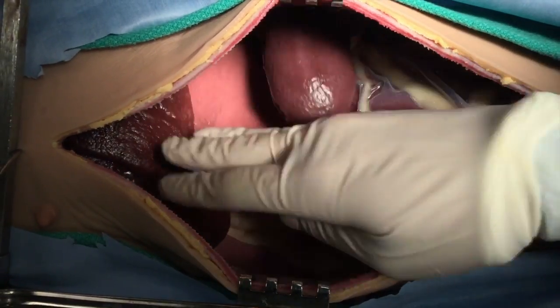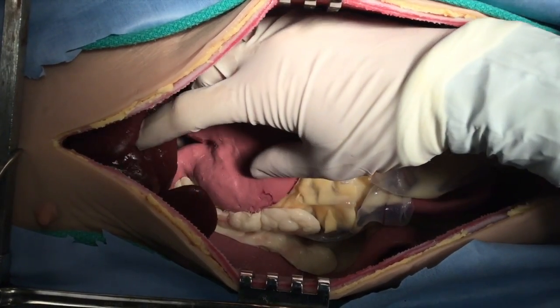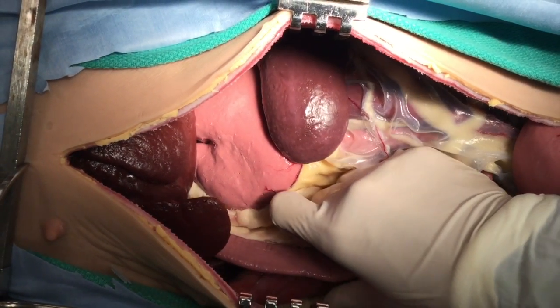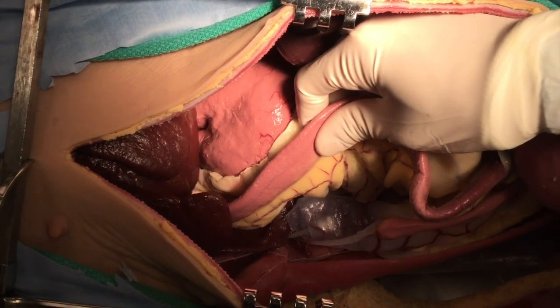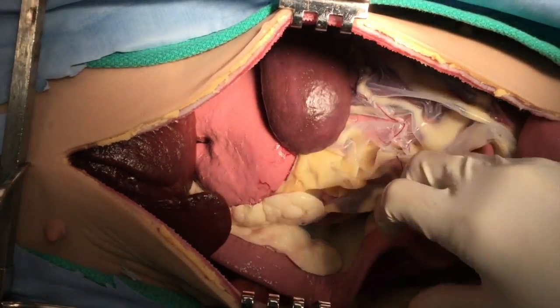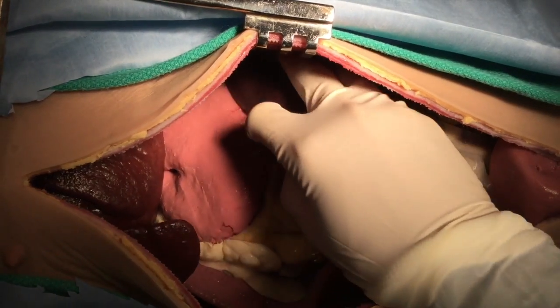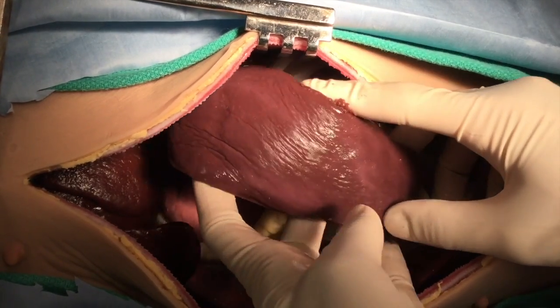Self-retaining retractors are applied and the exploration is started. I like to go from cranial to caudal — we can see the liver here, then the stomach. Then pick up the duodenum on the right and sling it towards midline using the mesoduodenum, where we'll expose the right paravertebral gutter and have a look at the associated structures.